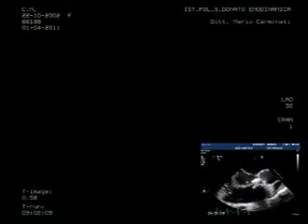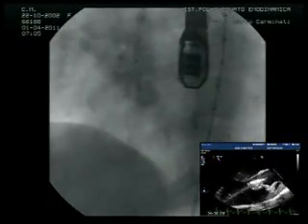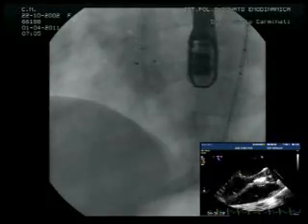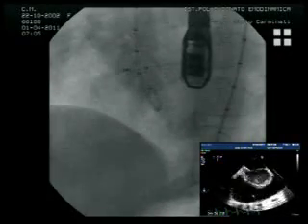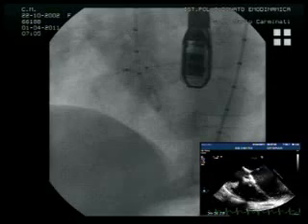Whilst we're live with you, just pull the pigtail back for me. Yeah, let's use a wire to take the pigtail back. Yes, una guida. Exactly, thank you. Otherwise it'll probably be all right, though.